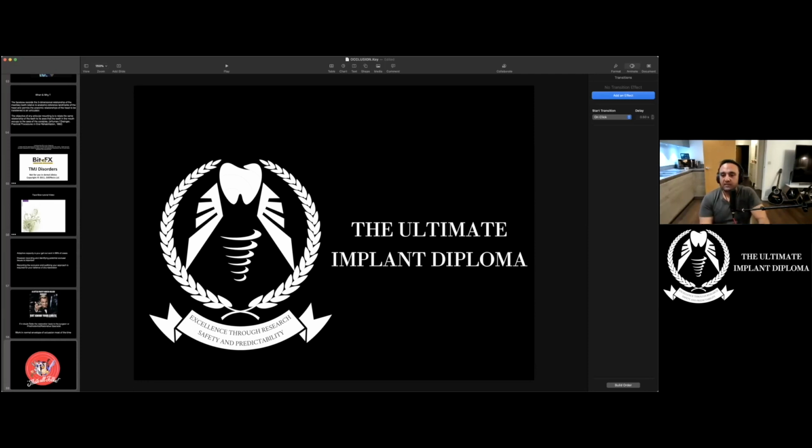Yes, you can do cantilevers if you have insufficient space, if you're measuring them exactly, but aren't there thinner implants that you could use? 3 millimeters, 2 millimeters. I don't really need to use cantilevers. I haven't used a lot of cantilevers in my career, and I've probably placed in excess of 5,000 implants. But there will always come that dilemma. If it's a lower anterior and the patient has a perfect dentition, no signs of parafunction, things like that, put one in and replace 2 lower small incisors. Possible. I don't see that being a major problem.